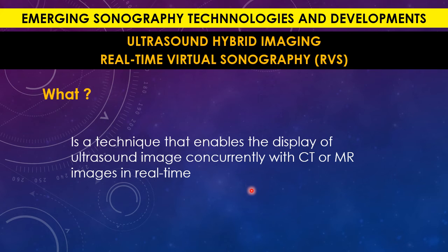So what is the hybrid ultrasound? With one of these techniques, ultrasound must be added to the CT or MRI. Okay, so it's a technique that enables the display of two modalities, ultrasound being one of them, and the other side must be a CT or MRI.